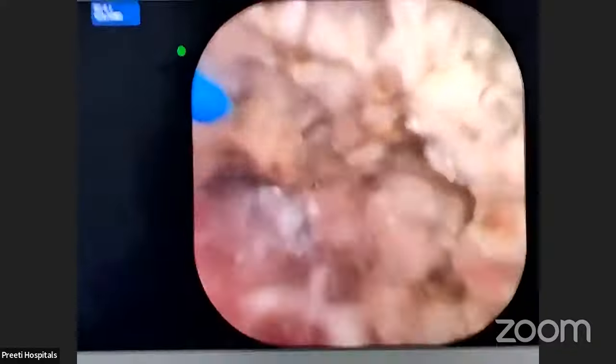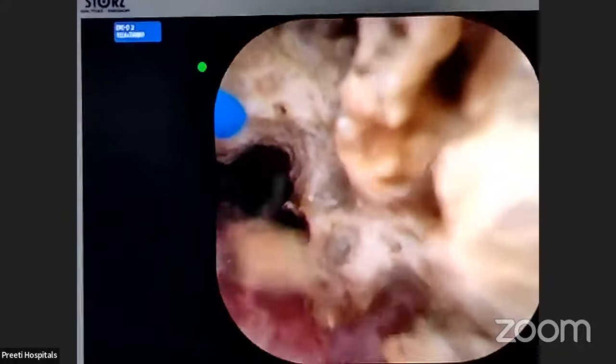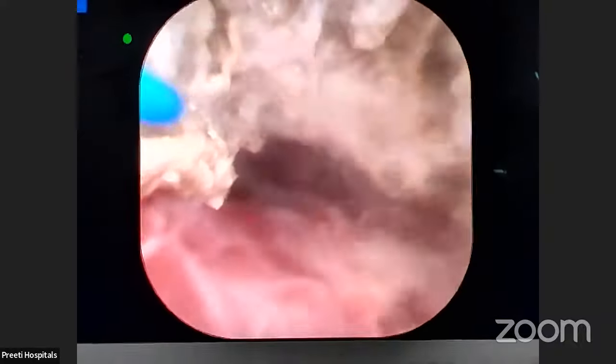Now, don't suck. When you are in the calyx, you should not suck. See, now everybody appreciates the suction of the fragments, powdering. This is normal RIRS. The only thing is large volume, 1.5 into 1.5 into 1.5. See, slowly I am seeing the upper calyx lumen. If you see the upper calyx lumen, it is easy. Why? The interface of the water and the stone will be there. Then surgery becomes easy.